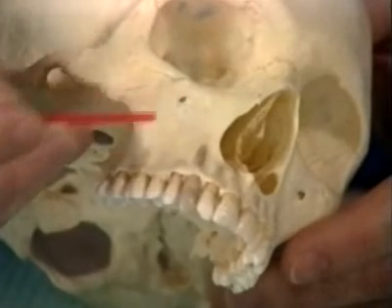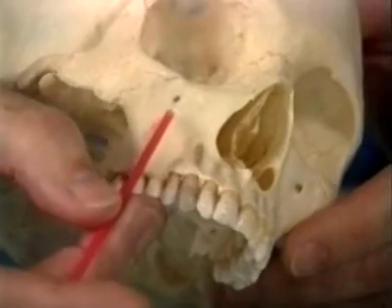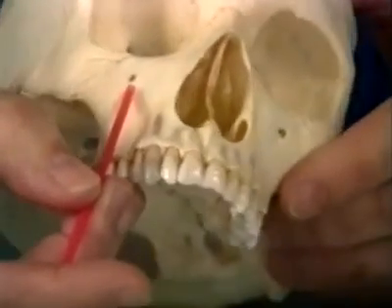Although several approaches have been described, the vertical approach is the safest and most commonly used. Before injection, it is important to locate the infraorbital foramen.